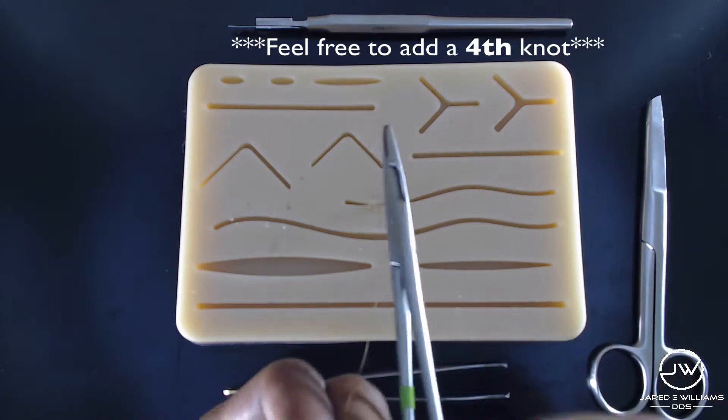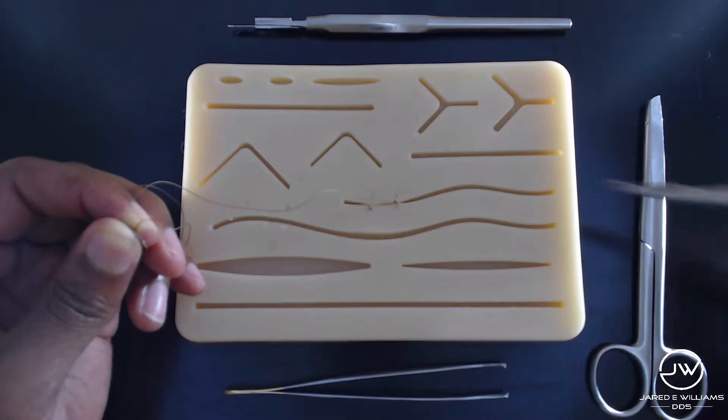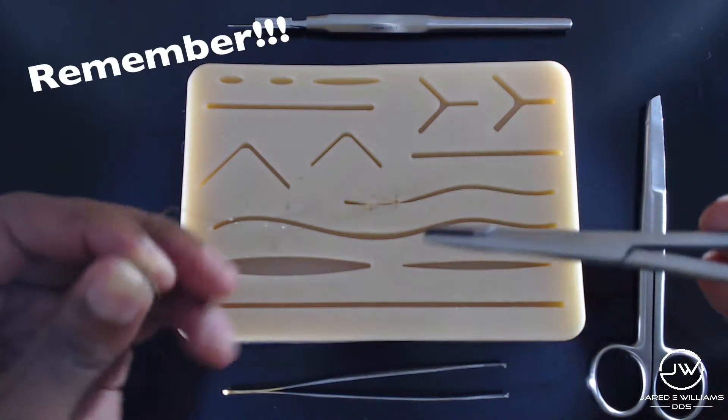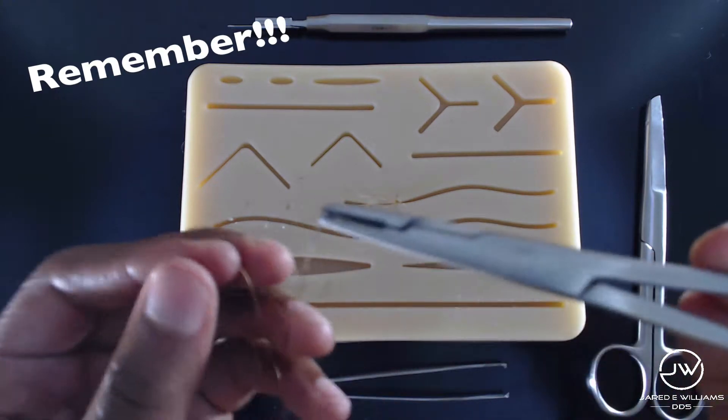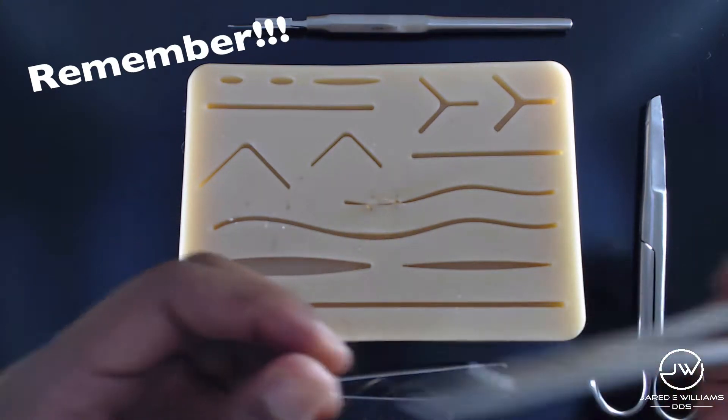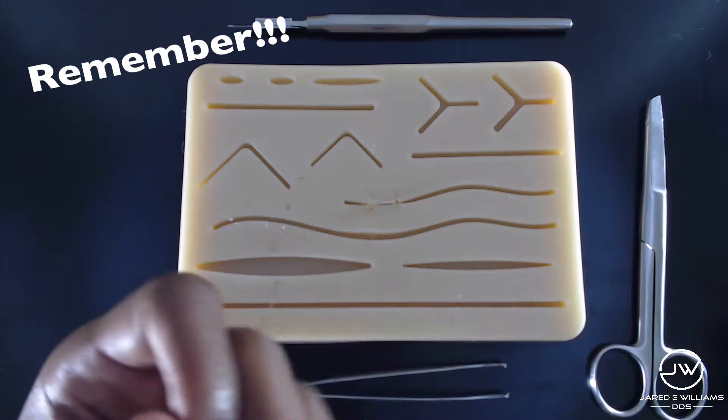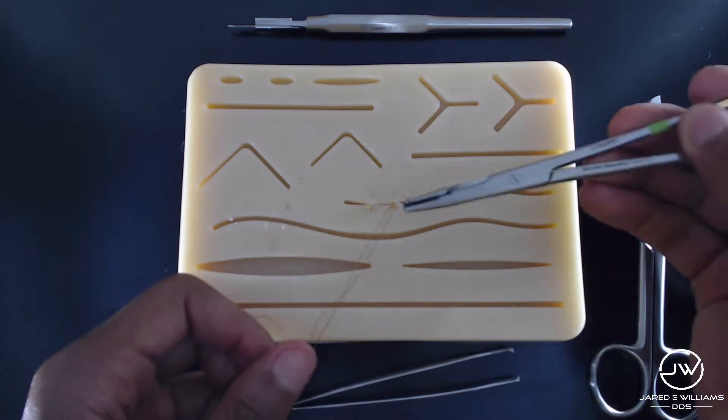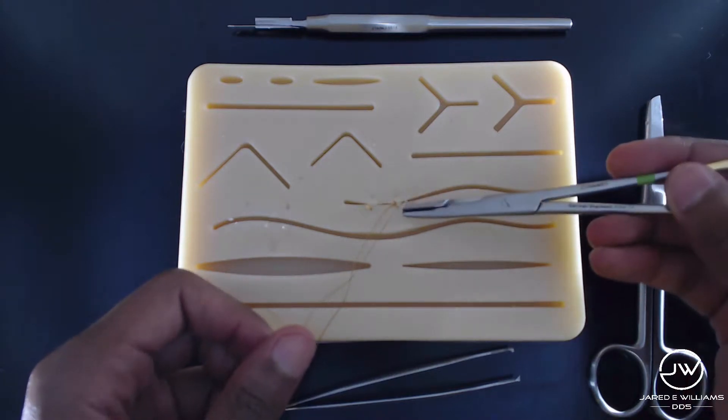And you want to make sure that you cut that tail that has about two millimeters left because this could unravel and ruin your suture and it could come loose. So, we're going to start our continuous suture here. And as you can see, that's just a simple interrupted suture. And we're going to go ahead and start our continuous process.